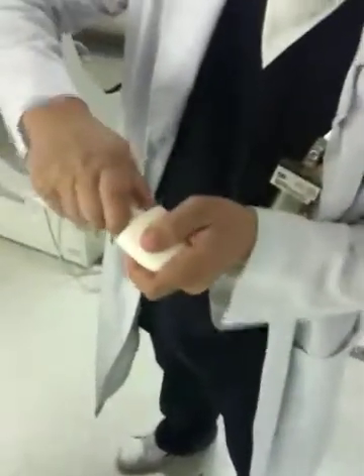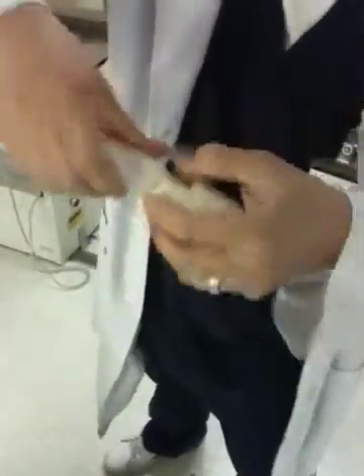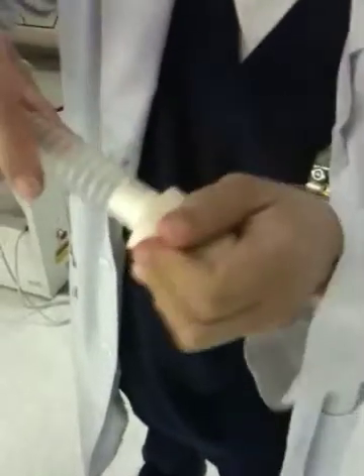Make sure you're tight over here. See this little two-wheel curve? Real tight, so it doesn't leak the aerosol. DTPA. This is for the mouthpiece, okay? And this is for the nose clamp.